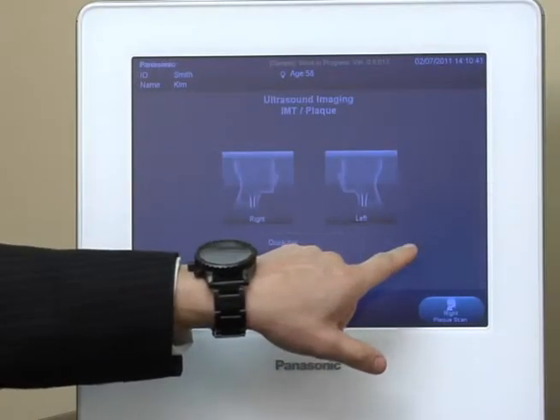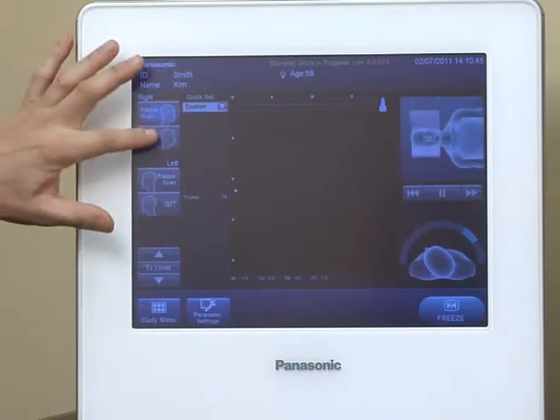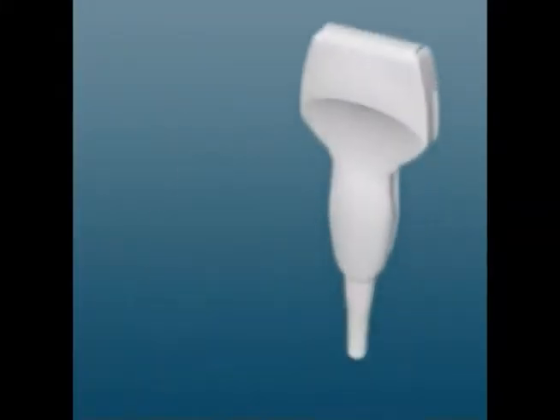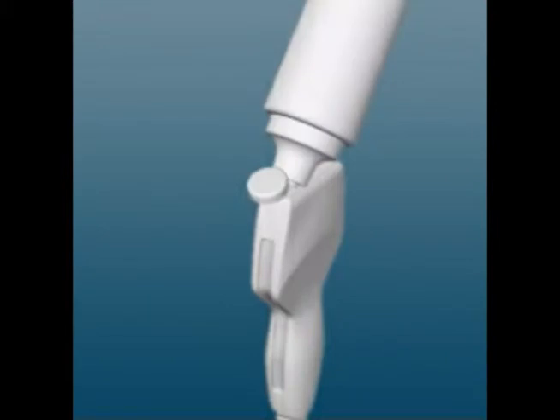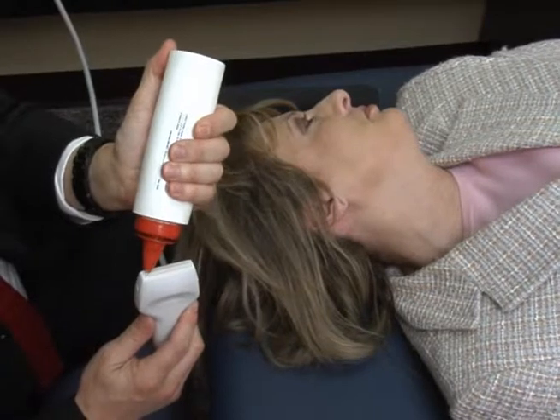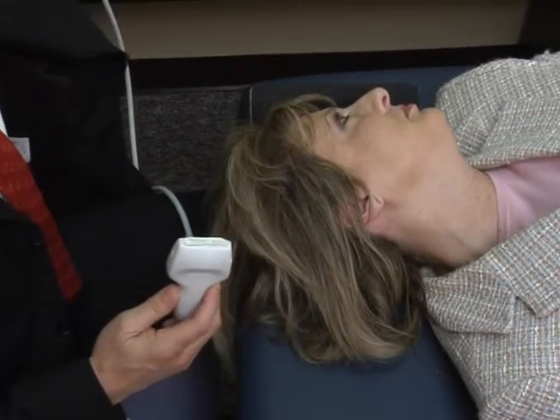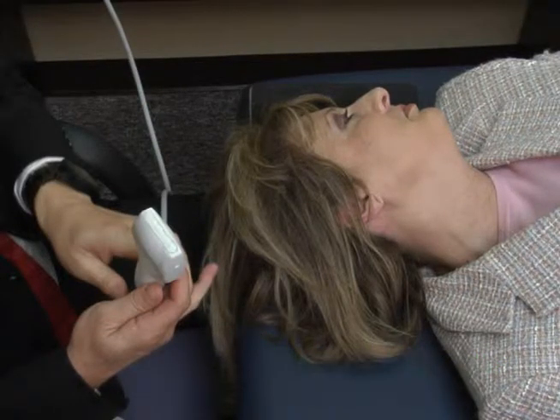Begin the study on the right side first. The probe orientation marker should face the patient's back, or facing the bed.